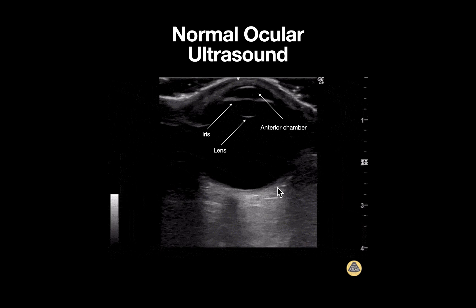Deep to this is our retina layer, which normally is indistinguishable from the back of the eye unless there's a detachment. This hypoechoic area here is our optic nerve.